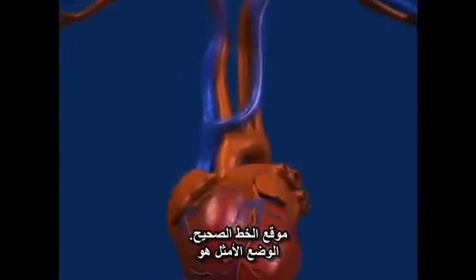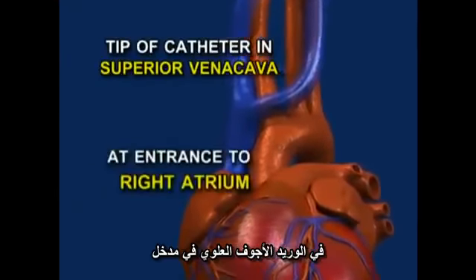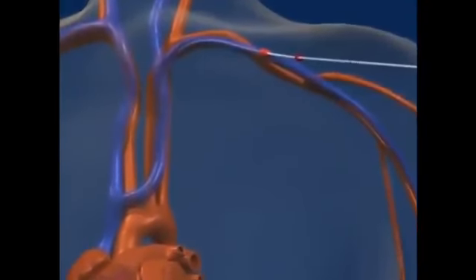The optimal position is to have the tip of the catheter in the superior vena cava at the entrance to the right atrium, but placement anywhere in the superior vena cava is acceptable.